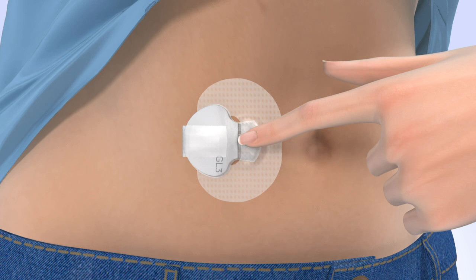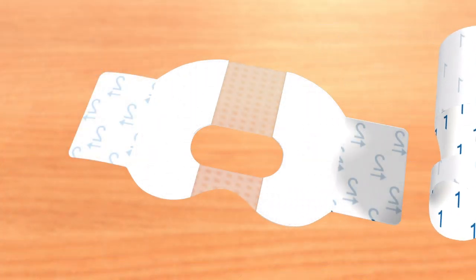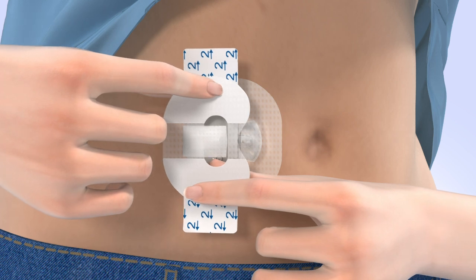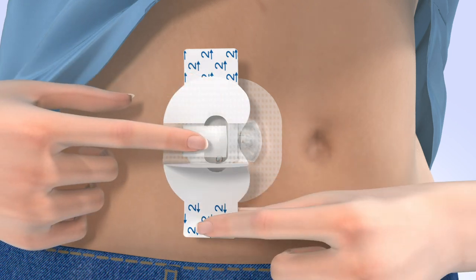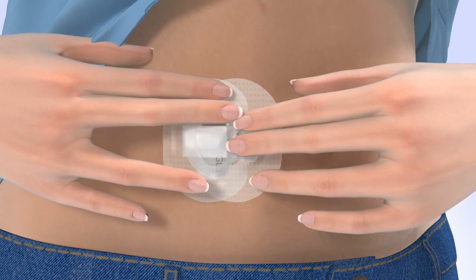Now you need to apply a second piece of oval tape to the transmitter. Remove the paper backing marked with the number 1. Rotate the tape and place it over the transmitter — the wide part of the tape should cover both your skin and the back of the transmitter. Smooth down the tape and remove the paper tabs marked with the number 2 from the sides of the tape, then smooth the sides of the tape.